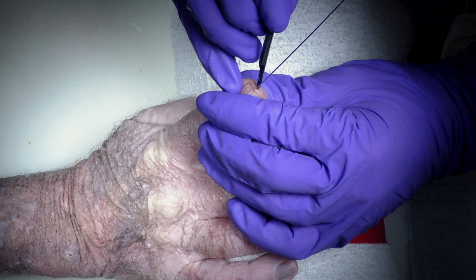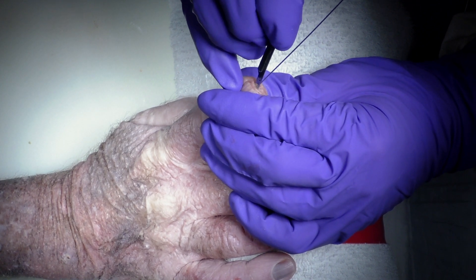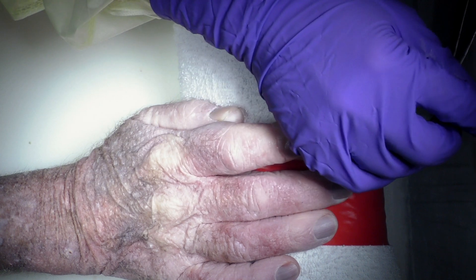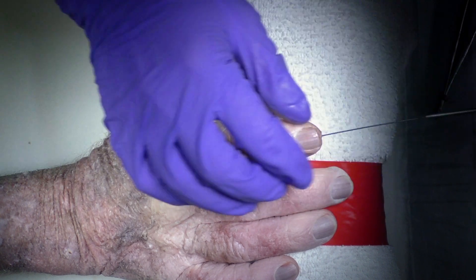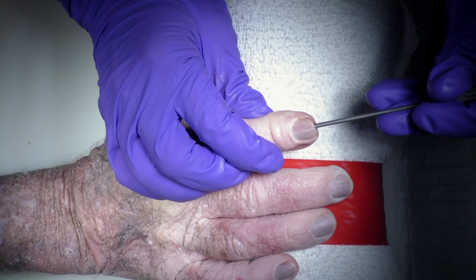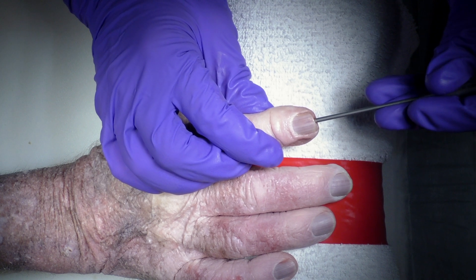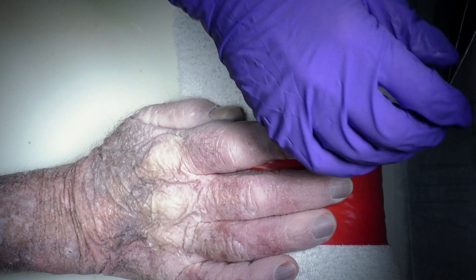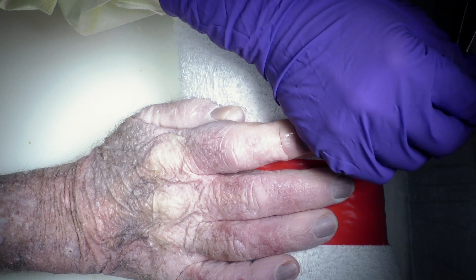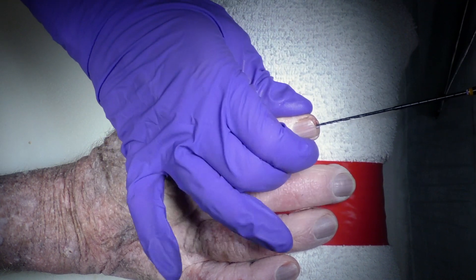Once you like your pin position, we can make a small transverse incision in the skin and then we're going to use the depth gauge to identify the length of screw we're going to use. This is measuring 44mm, which is obviously longer than what we need, and so we will use a 30 millimeter screw, knowing that it will be fully buried within the distal and middle phalanges.